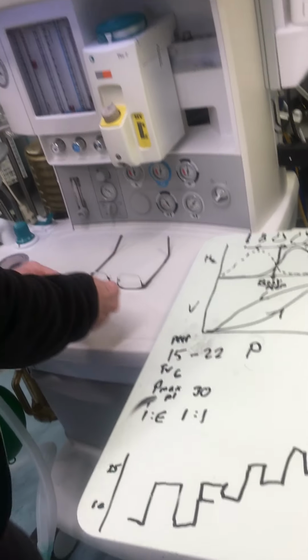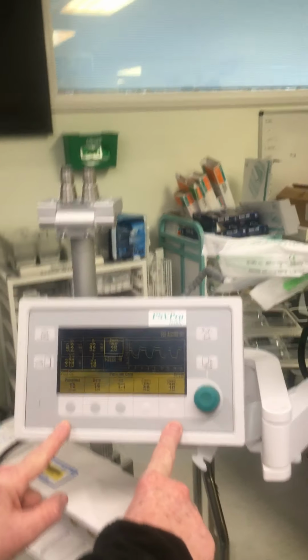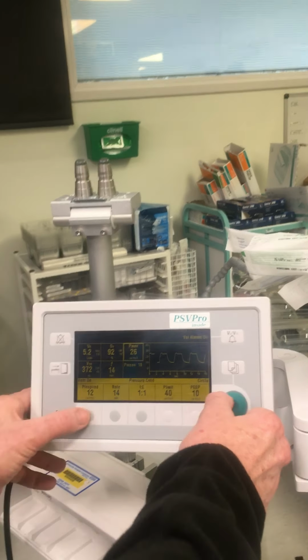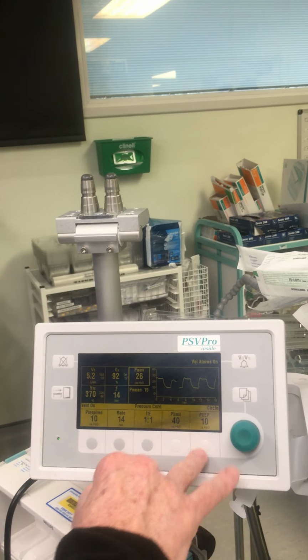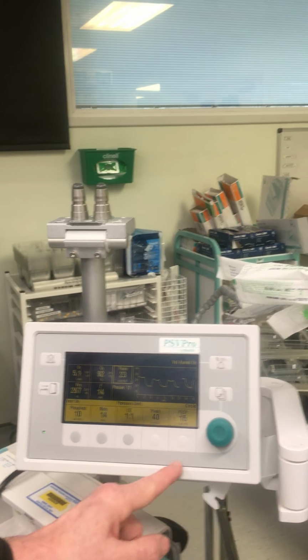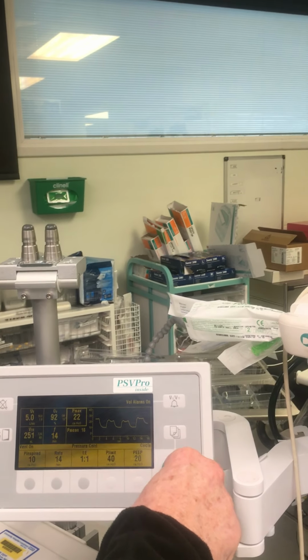So what you're increasing? I'll show you. So here we've got 25 as the peak pressure, 10 as the PEEP. So I'm going to actually drop this to 10 over 10. But actually, I'm going to put that up to 15. So now what I've done is I've dropped my driving pressure to 10. And now I'm just going to serially ramp the PEEP, which will ramp the peak airway pressure.